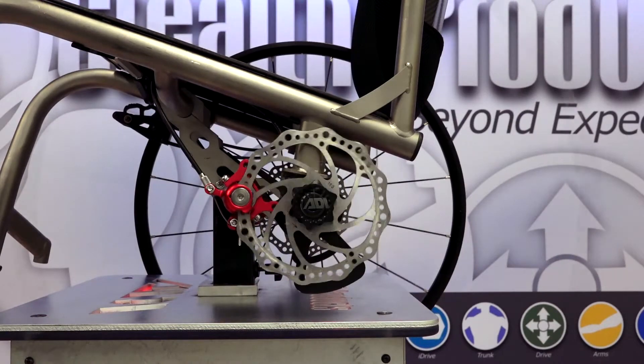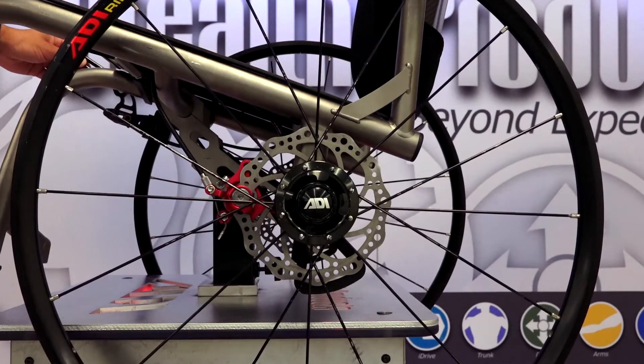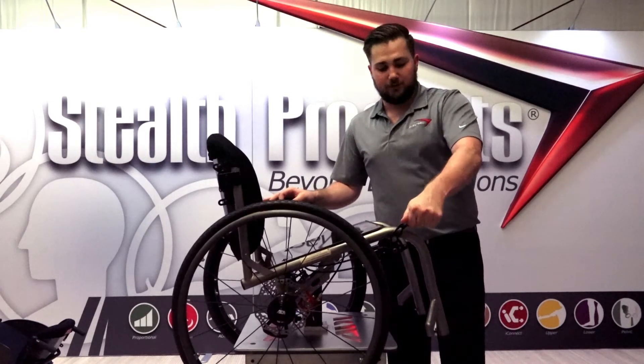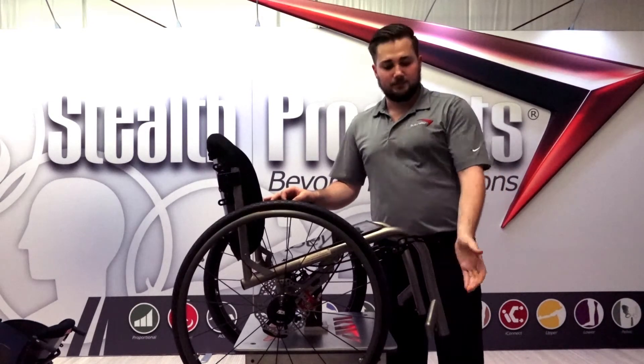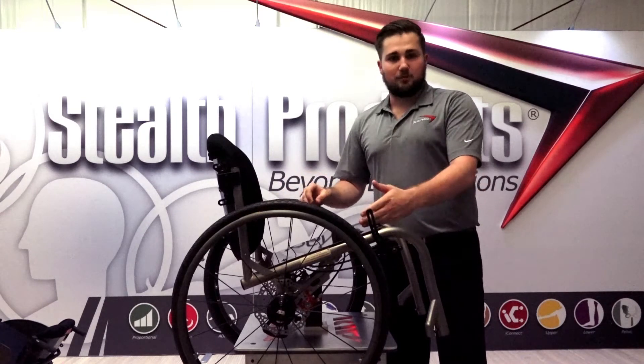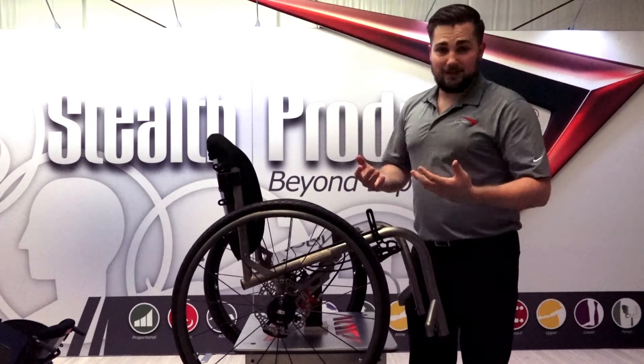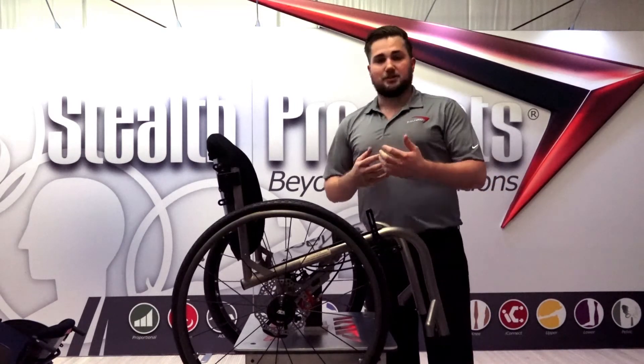We call this the variable lever system. It's a one-lever system that actuates both wheels simultaneously. The reason we call it the variable lever system is that you have five variable stages of braking force, all the way into the fifth stage, which is your full-on lock.